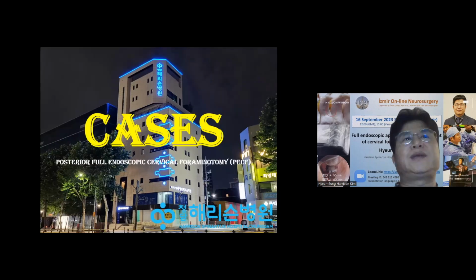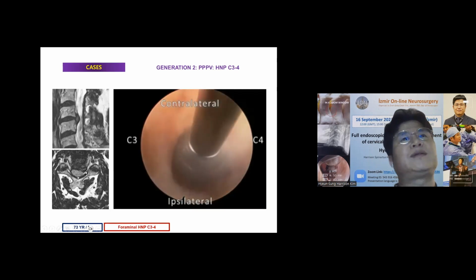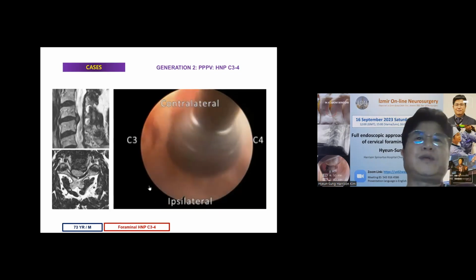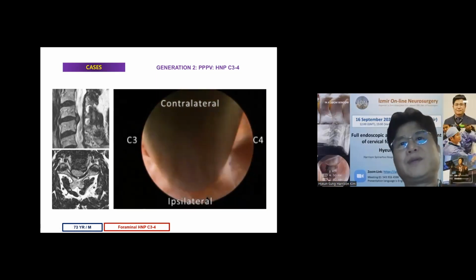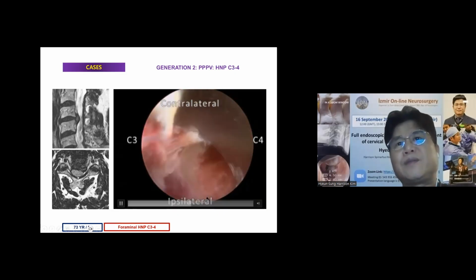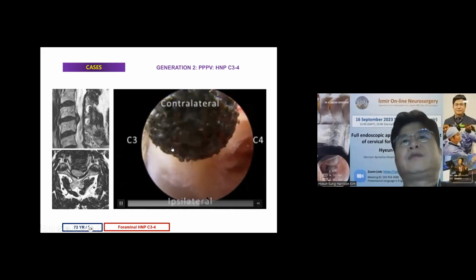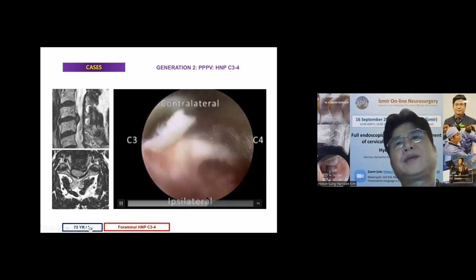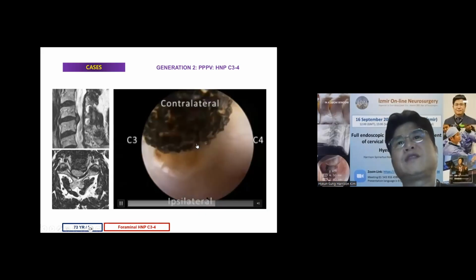So you can see maybe this C3-4 cervical disc. This is not the anterior cervical approach, but this patient has such severe pain. After the first foraminotomy, you can see here, can you see this pedicle? Partial pediculotomy, and insert the small working channel, and then the disc drilling is also done. Now you can see some traction, more safely. This is the disc.